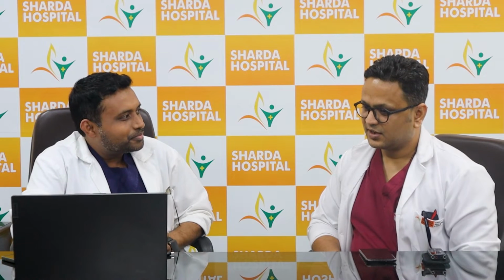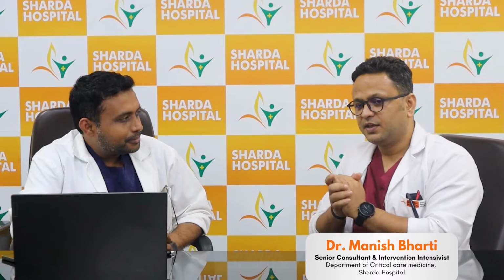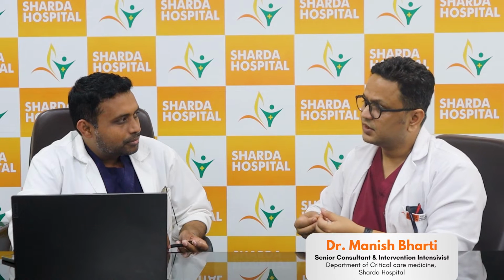Dr. Manish, can you tell me what is the purpose and role of bronchoscopy in the ICU? I think it's a very wise question, Dr. Ankit. To simplify for our audience, bronchoscopy is a procedure where you see the lungs and the windpipe, and identify any abnormalities related to the tracheobronchial tree. Any patient who has a disease of the lung, or where we expect problems with the airway, we scope them.